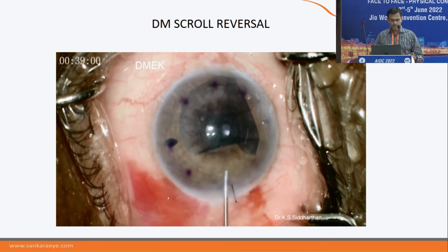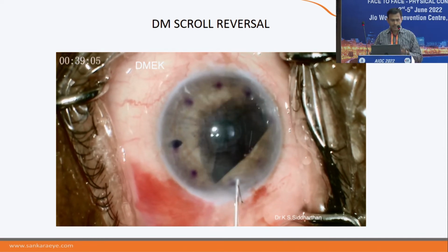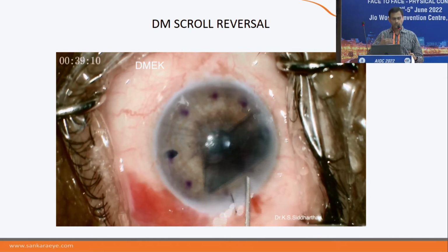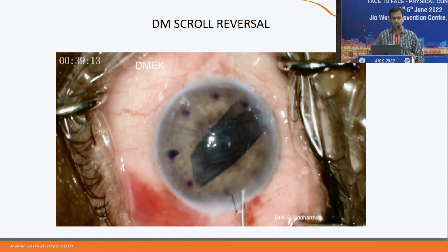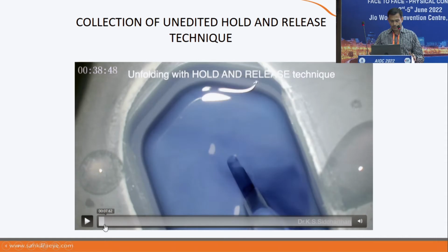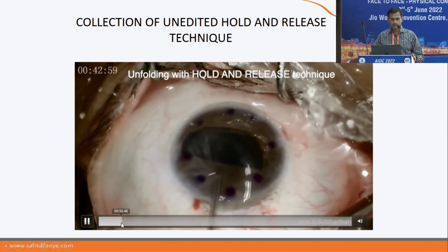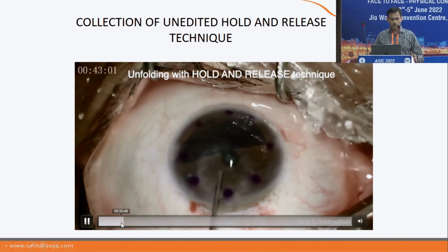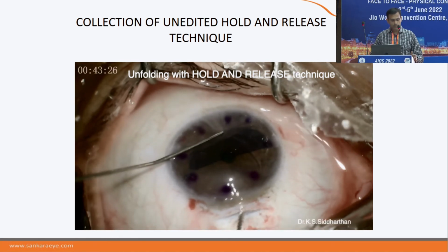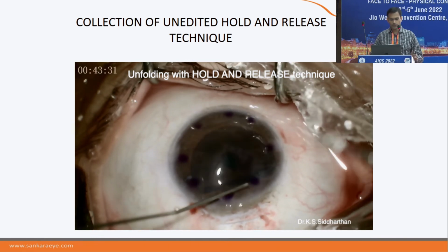So you see that I'm injecting saline over the inner flap. I keep on injecting on the inner flap, and see how the inner flap comes out. So that's very, very important. You have to give the flow on the lower inner flap so that it comes out. A few videos, because of no time, I'm just going to forward. The only thing I want to keep telling you is, always make it horizontal, hold it with your left hand, keep injecting saline, shallow it. Injecting saline is the key. That makes it really easy for it to unfold.